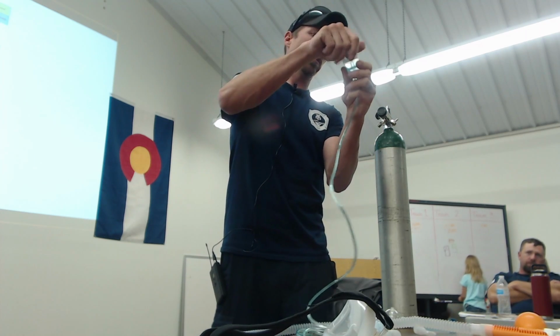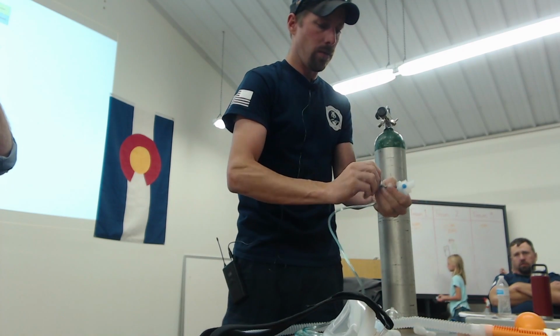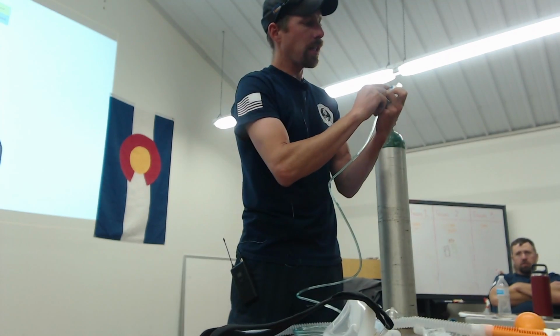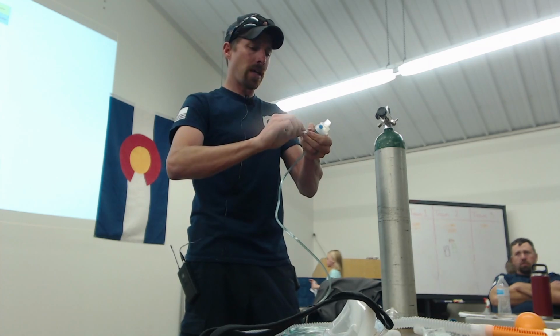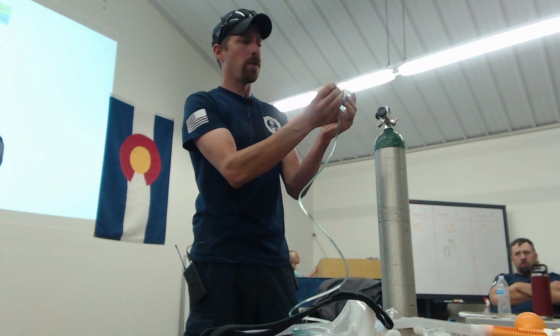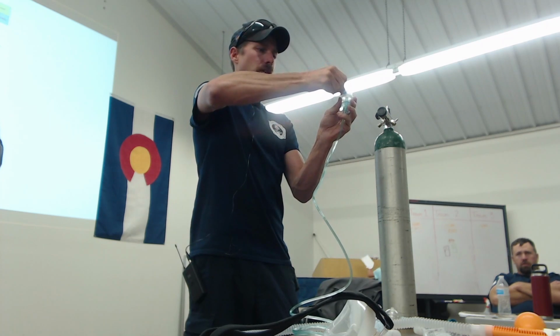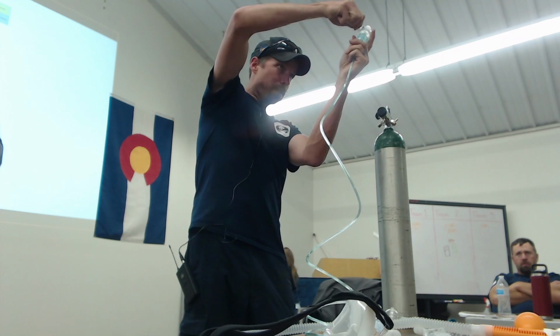So the advantage of the nebulizer with the little blue port is that it's got a slit pre-cut into it, and it's kind of like the top of a vial. Works the same way, only it's designed to interface with your typical albuterol or duo neb, and you just can shove it in there and then squirt your medication straight in there. So you can see now I've got my meds in there.